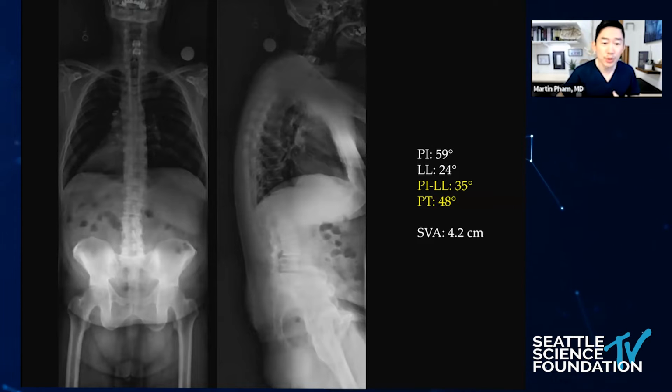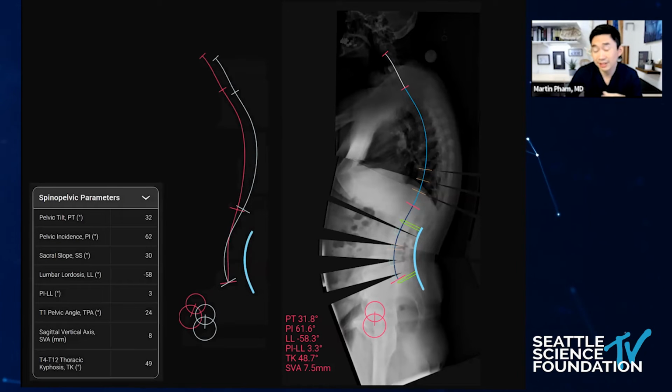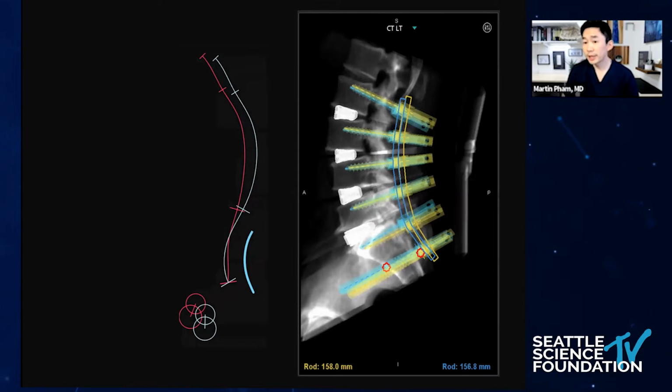He was in the Navy, used to move around ordnance, right? So moving around missiles and bombs, so a huge guy. That's probably why he's able to retrovert his pelvis so much because of his imbalance. So in looking at this gentleman, as a virgin case, we figured, is there a way to offer him a minimally invasive option? If we put in cages at those levels from L2 to S1, will we give him back enough to balance him? This is what the patient-specific rods and predictive analytics are meant to do, to try and see if that's enough. Now, in moving forward with that plan, again, as I've shown you earlier, the robot needs a plan.